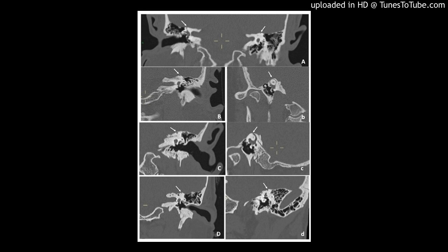After adequate exposure, the superior canal is plugged in its posterior and anterior end very slowly with small pieces of muscle, Figure 6, and covered by fascia and by bone pate, Figure 7, to ensure robust obliteration. The use of bone pate directly through the blue line defect or even over the muscle is not recommended, in case small bony particles escape into the labyrinth causing significant dizziness.